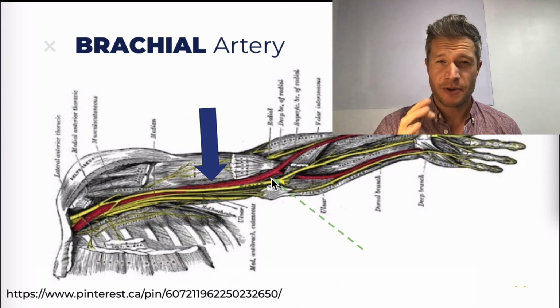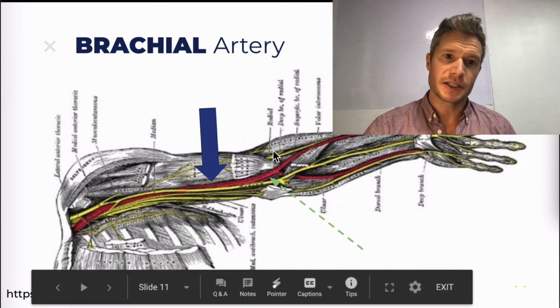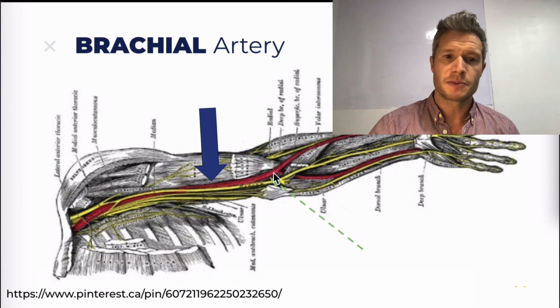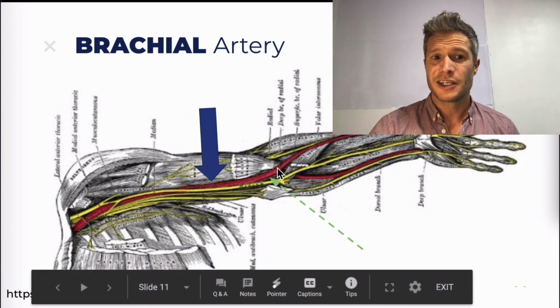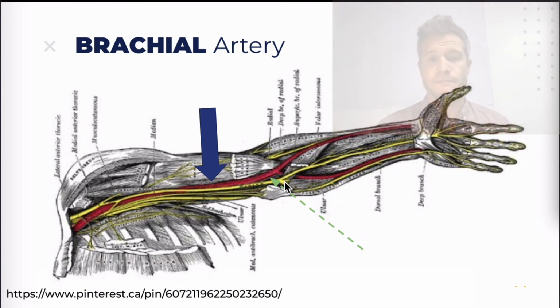People kind of have a better place than others to hear. There's always individual differences, right? So if you kind of notice on this graph, you have your epicondyles of the humerus that stick out and it is roughly in line with that. But again, sometimes people's arteries are kind of tucked behind their biceps a bit more. Their forearm muscles are a little large, and it's really hard to get a good sound in there. So it'll take practice. So make sure you practice this.